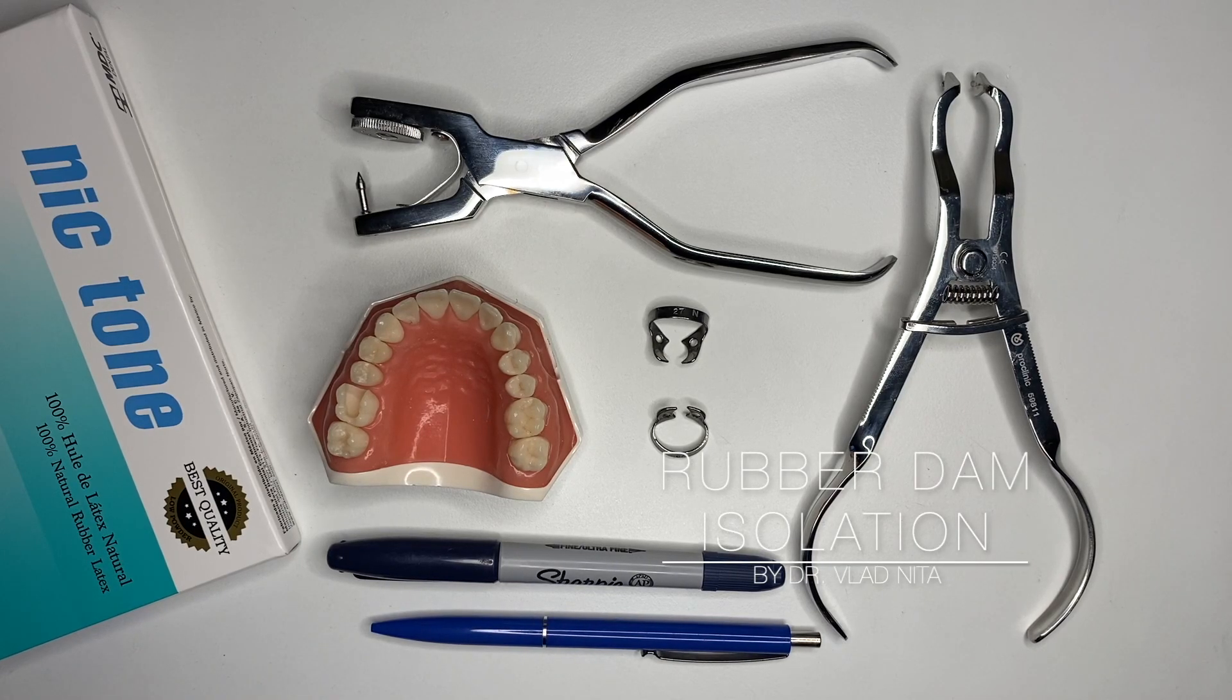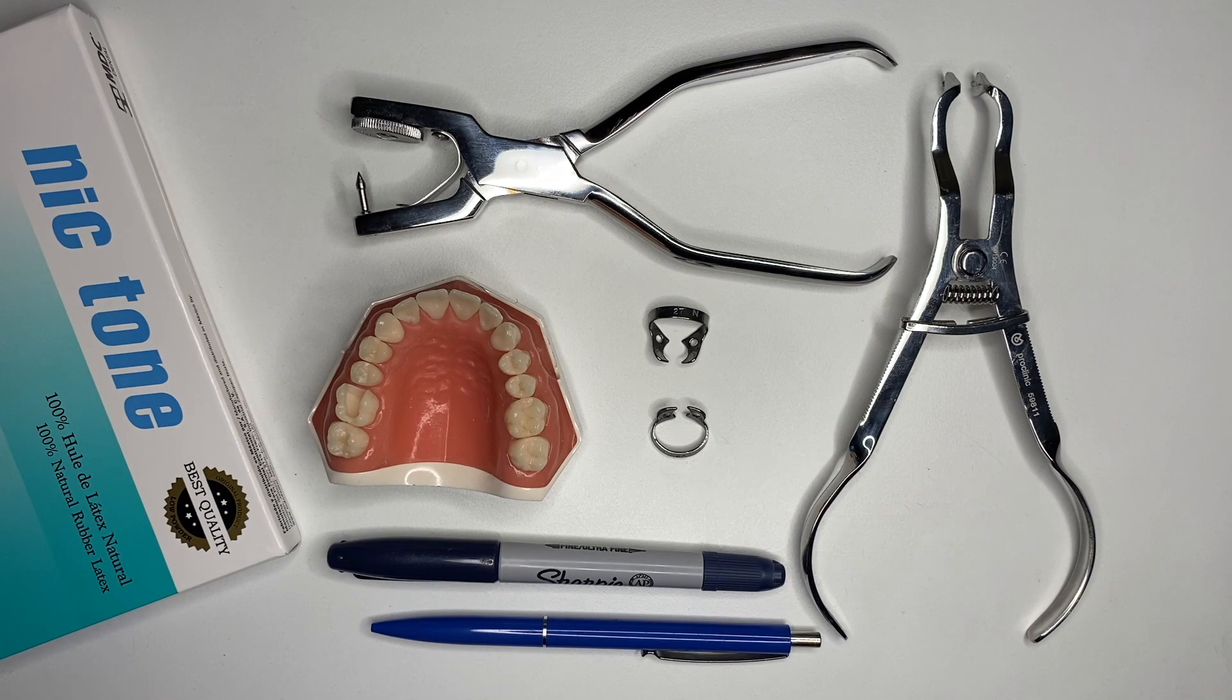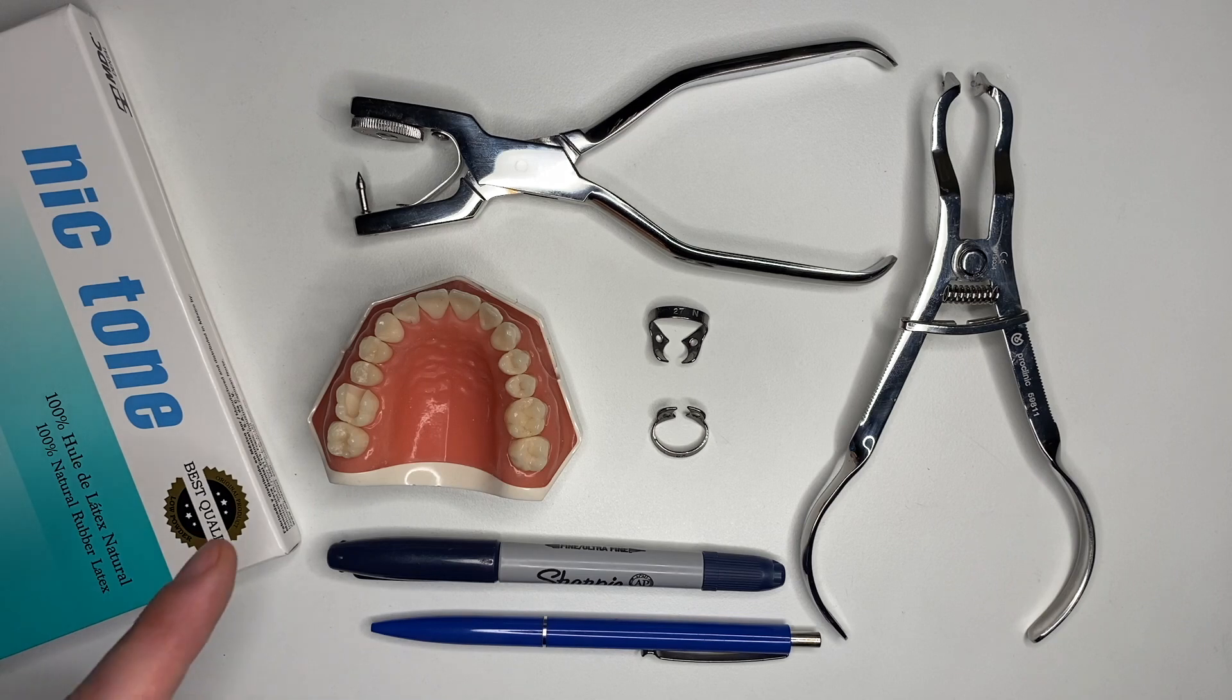Hello everyone, it's time to put one and one together and see if we can do something with all the things that we discussed in the previous videos. Today we're going to try to set up a rubber dam on the first quadrant.